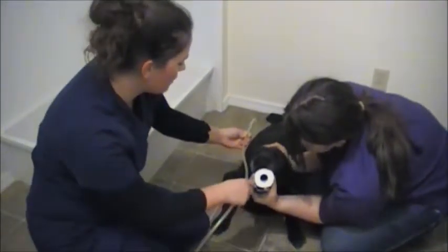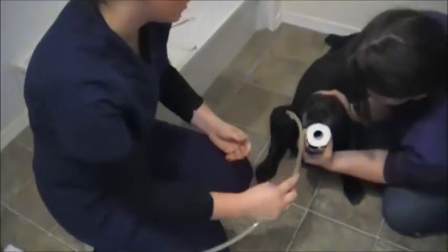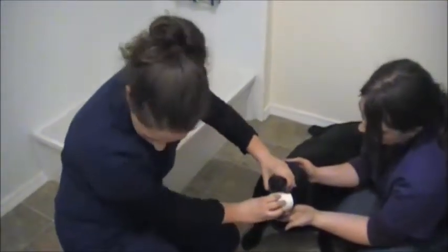Once the medication's been given, we just gently back the tube back out, slowly without forcing, until we've got it back out comfortably without hurting her, and then take the speculum out.